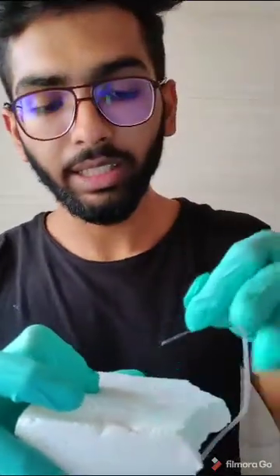Bind the tourniquet on the upper part of the hand so that the veins can swell up and become more visible, and we will pull the skin longitudinally so as to make the veins stable. Then as I pull the skin backwards, I will use the scalp vein set here at ideally a 35 degree angle for reaching the vein. As you reach the vein, you will be able to see the blood in this.